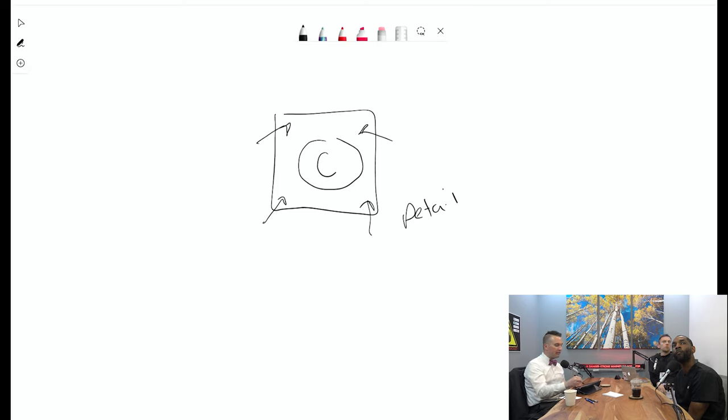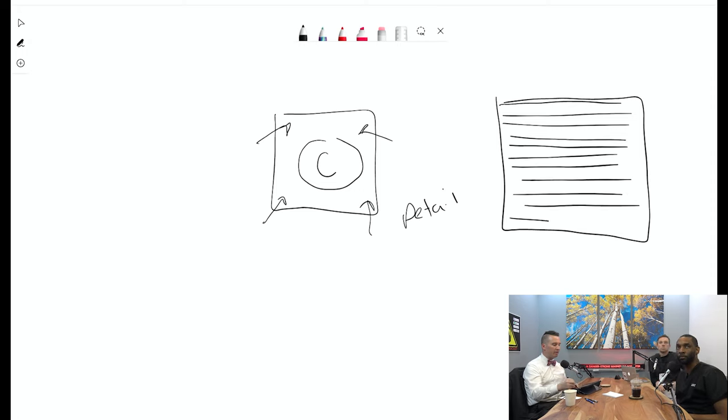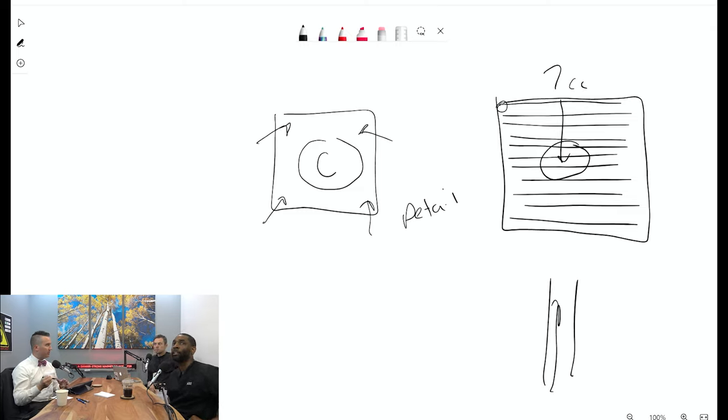Okay? So in this case, and these are the older scanners, they will scan like this. It wasn't very scientific. You'd say, I don't know why, but as soon as I see the lungs blush, if I hit start, then it always gives me a really good filling of the carotids. That's because you were filling Cartesian in a linear fashion. This would be your time to center, from here down to here, however long it took you, say a time to center of 7 seconds. So you're trying to hit the time to center exactly when the contrast is coming up and filling the actual vessel at its brightest. It's not very scientific, especially when patients have various different cardiac outputs. For sure.